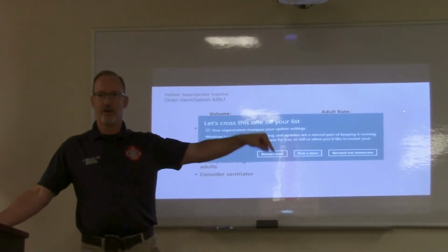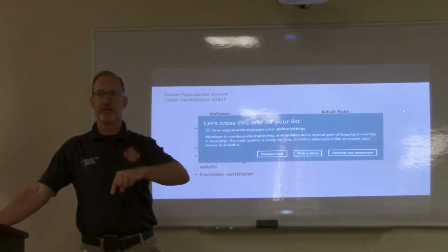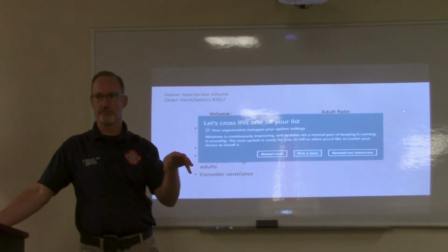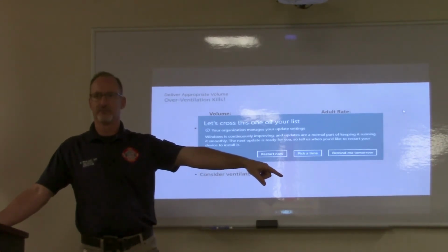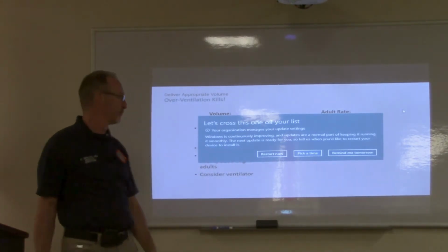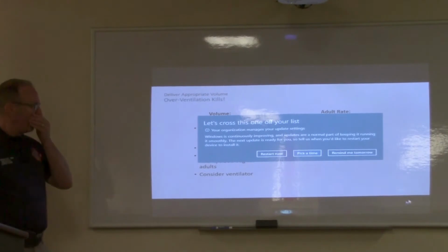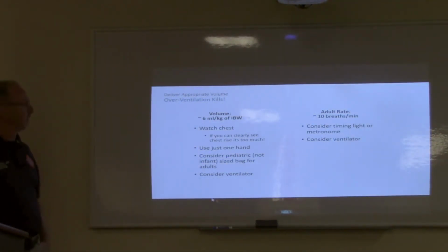Cardiac event: non-rebreather, minimize our positive pressure, focus on other things, even if you have all the hands in the world. Respiratory event: go straight to bagging. Don't overbag, but go straight to bagging. Does that make sense? So it's a real important distinction. It's a detail, but really important. Okay, and I think we're going to spend most of our time on bagging today, which is great.